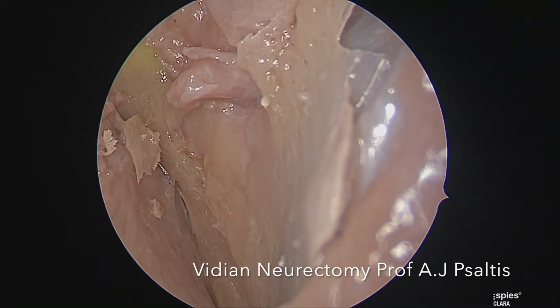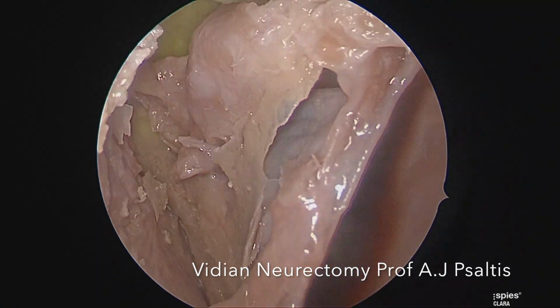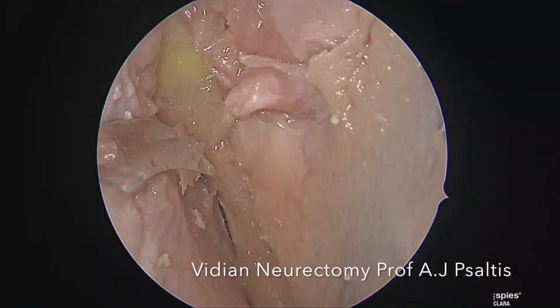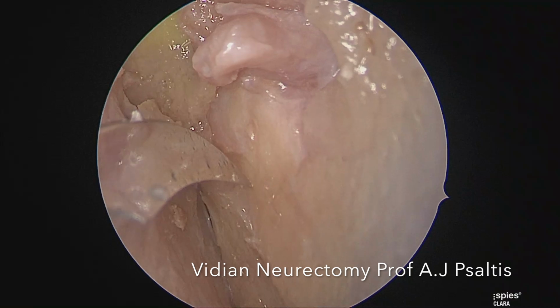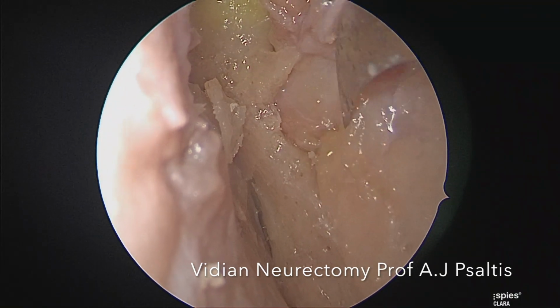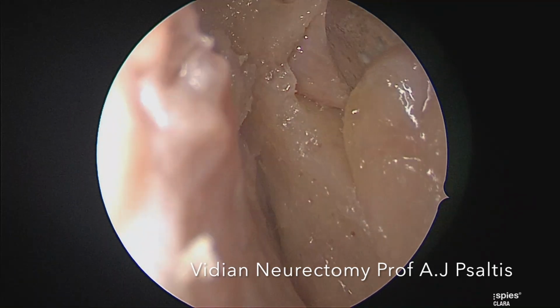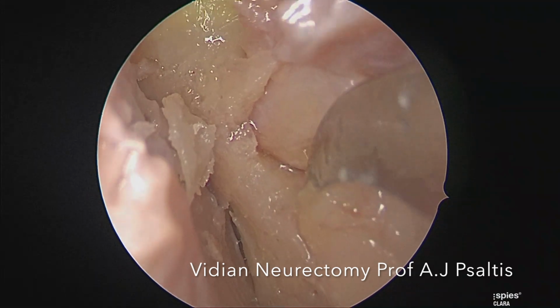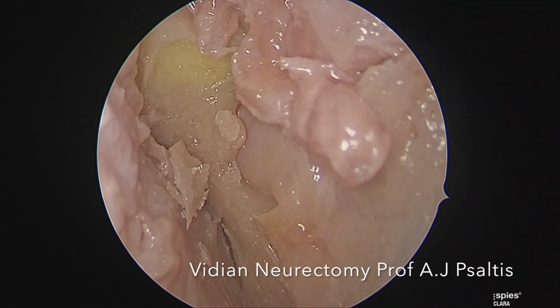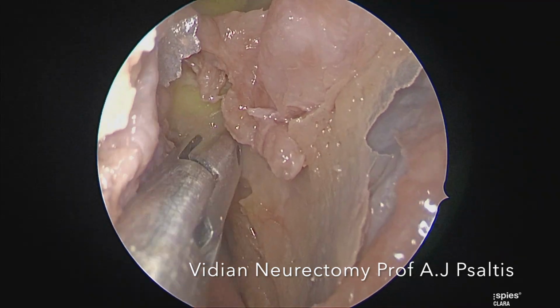Once this bone has been removed, you can then direct your attention posteriorly to the posterior lip of the sphenopalatine notch. Removal of this bone will gain access to the posterior nasal nerve, which runs parallel to the palatine process. Here we can see the posterior bone being removed with a Blakesley.